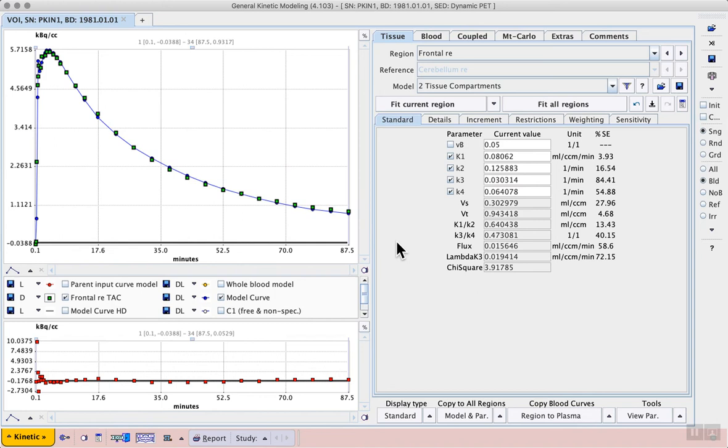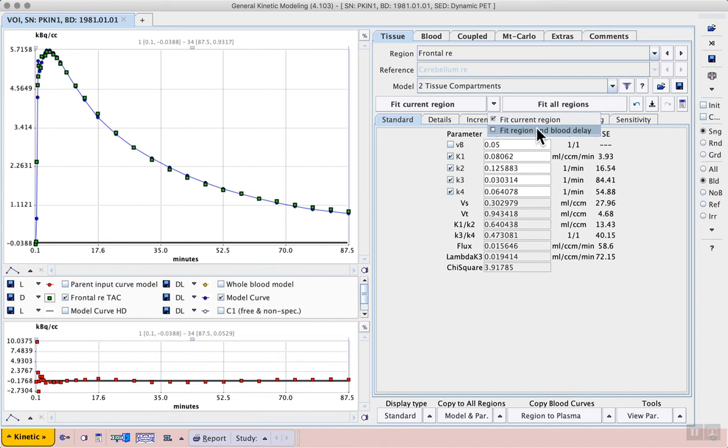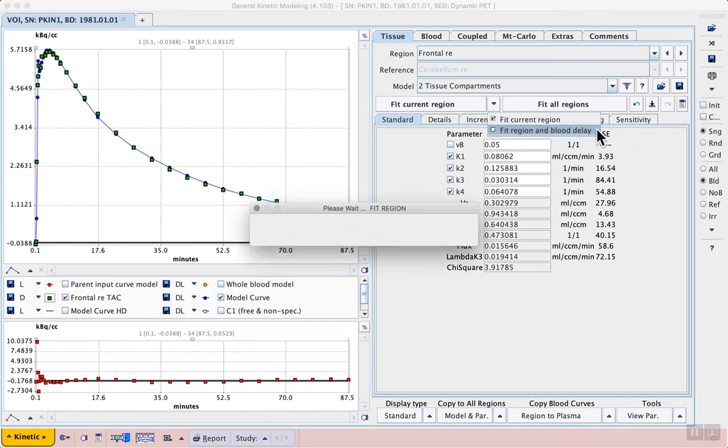The delay that we entered on the blood tab can also be included in the model fitting and this can improve the reliability of the model results. So from the menu next to the fit current region button we can select fit region and blood delay.